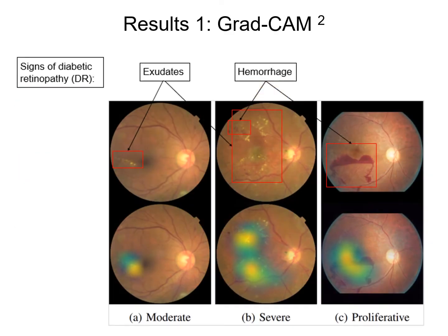First up is GradCam, which stands for Gradient Class Activation Mapping. This creates a heat map of which pixels were activated the most to inform the classifier what the output is. Here are the signs of diabetic retinopathy, for example, the presence of exudates, which you can see here and here. The AI model recognizes this as a sign of DR, and when we overlay the original image with a heat map, we can see that these pixels were most used to inform the classifier of its decision. GradCam is becoming a standard practice and is a simple, usable technique in interpretable AI image analysis.